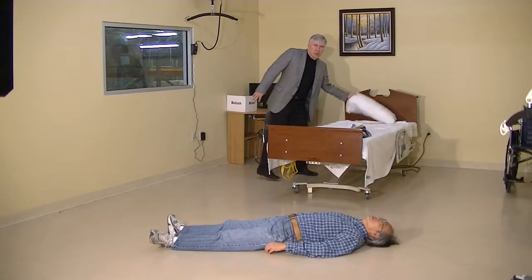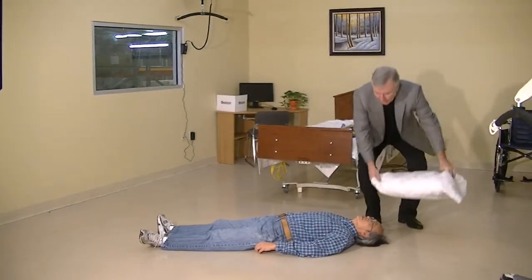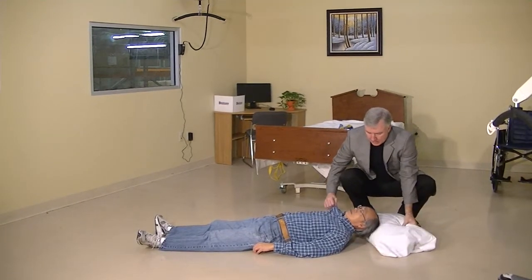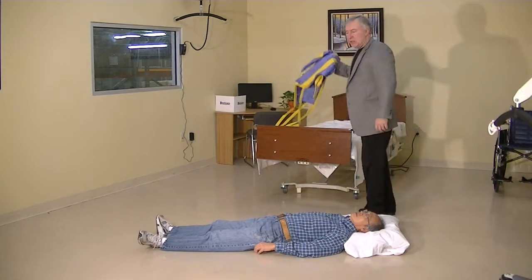So our patient is on the floor. The first thing we want to do is try and make the patient comfortable. Let's grab the pillow and put it under the patient's head so they can be supported and comfortable enough for us to take the time to apply the sling.